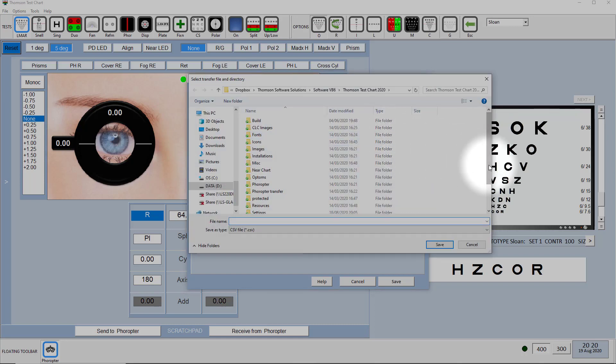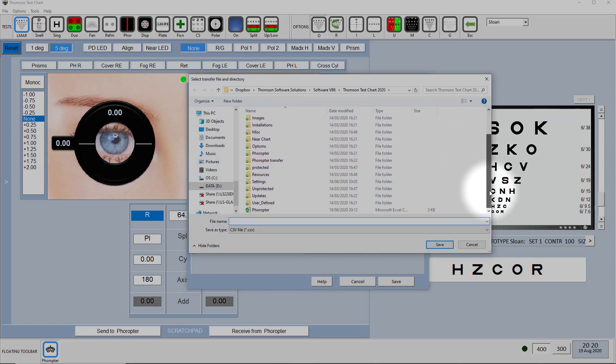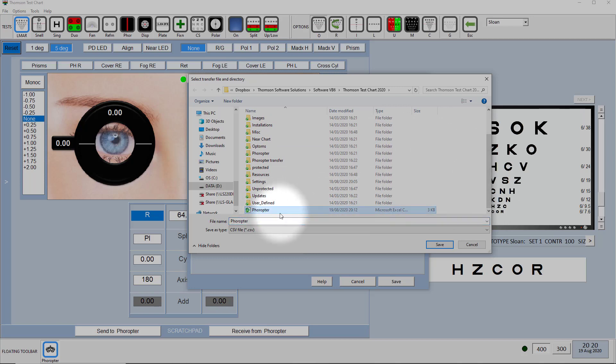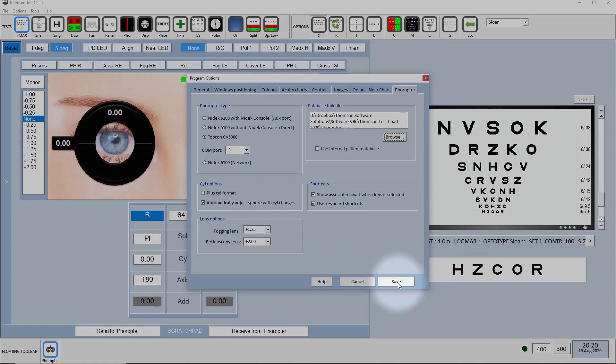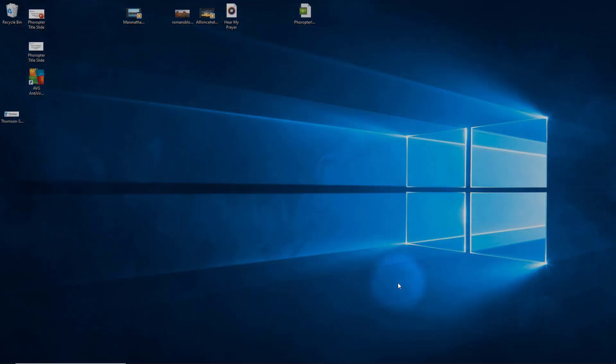You need to navigate to the file that's been saved by your patient management system and then select that and click on save and then save here.